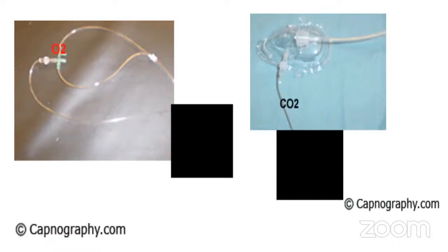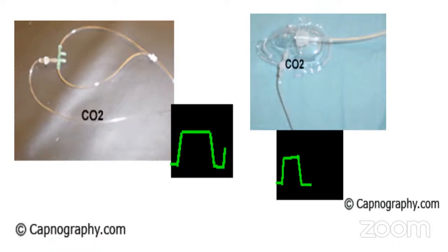Maybe use in intensive care, especially to assess the cardiac output and dead space ventilation, especially in ARDS, and during the fluid resuscitation, we had to validate these three areas. Nice presentation, madam. Thank you.